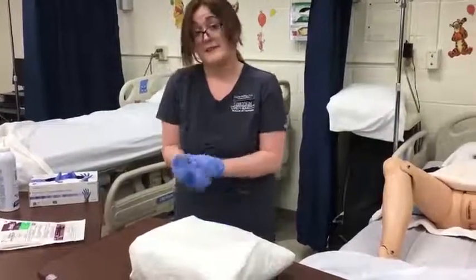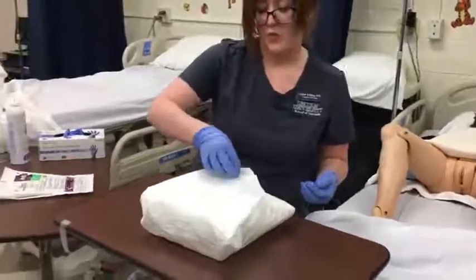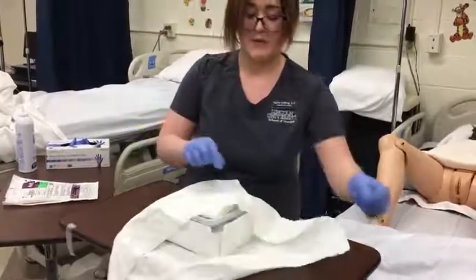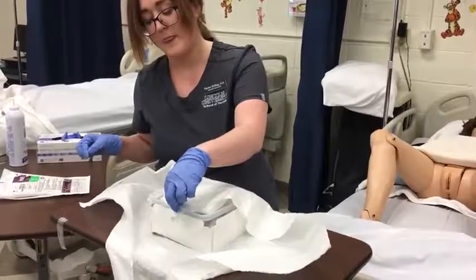Now I'm going to begin setting up my sterile field. I'm going to open this away from me in order to maintain the sterile field, remembering that I have a 1-inch margin that I can use.